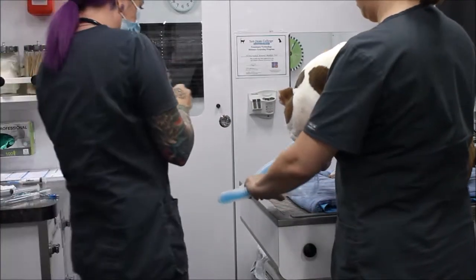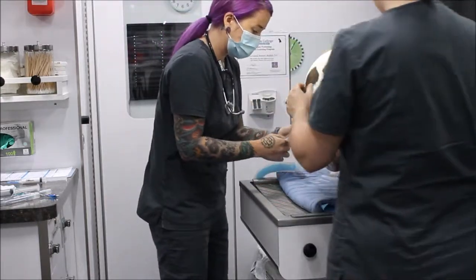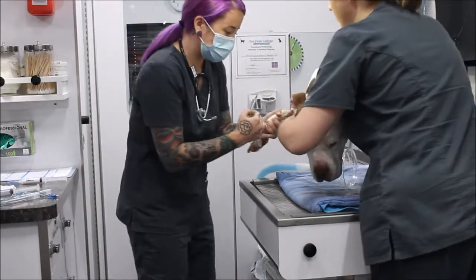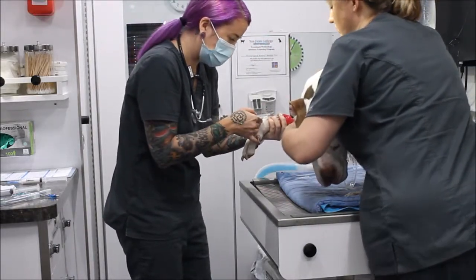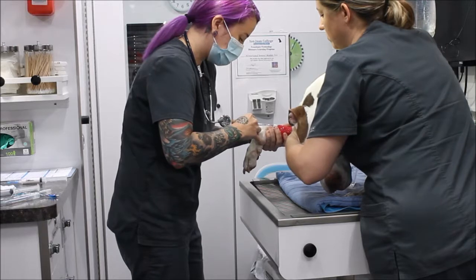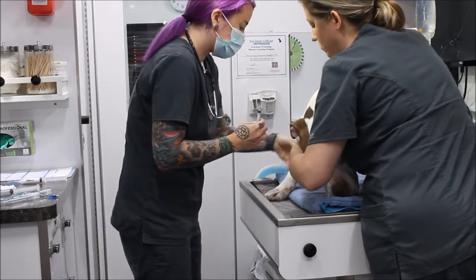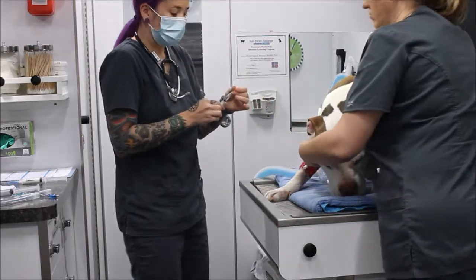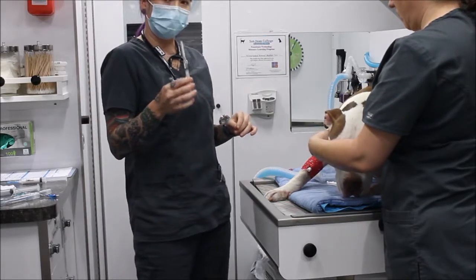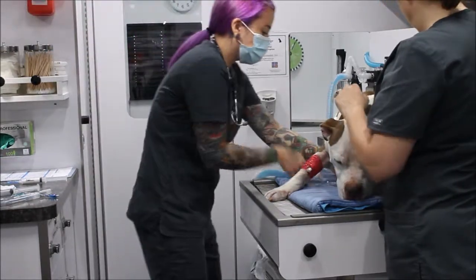Now I'm going to flush his catheter and check its patency to make sure I don't see any swelling. I give a minimum of about 2 mls and everything looks okay — no swelling. Our sterile saline solution has been diluted with heparin at about 5 units per 1 ml of sterile saline solution.